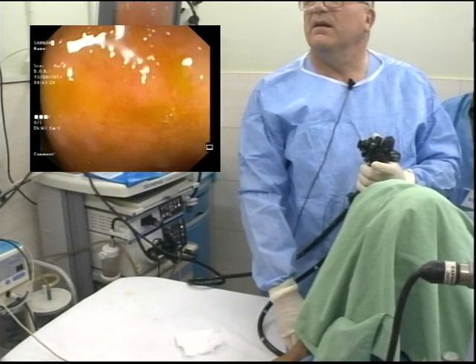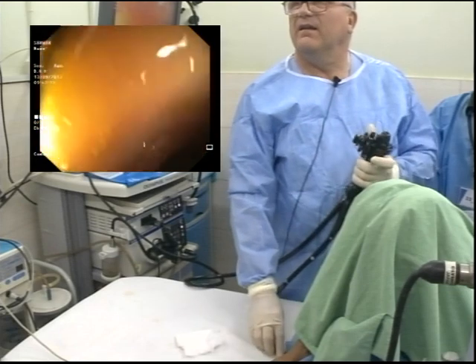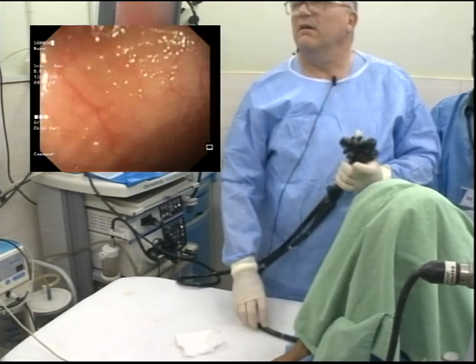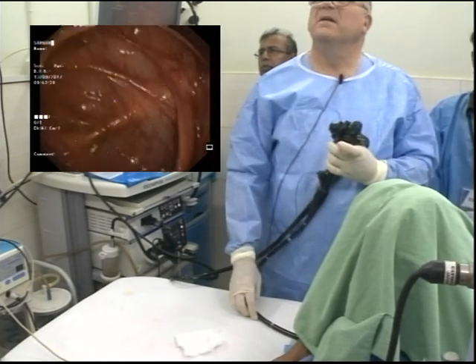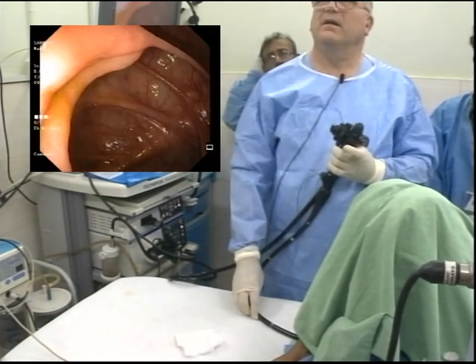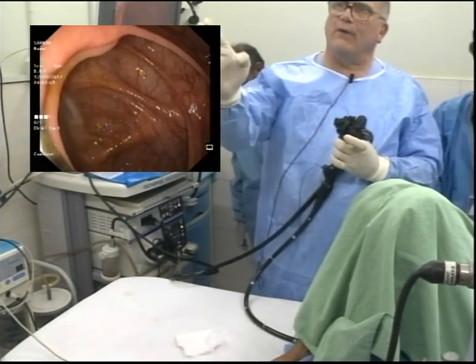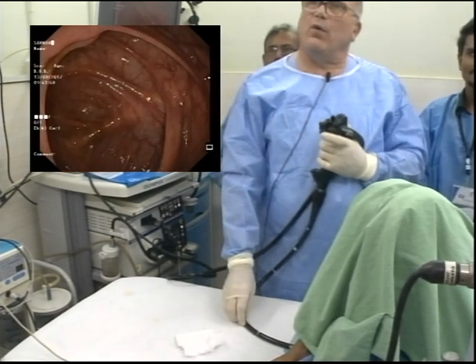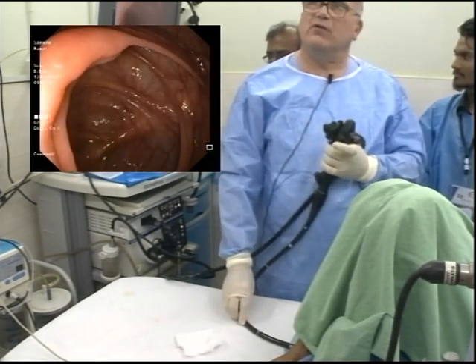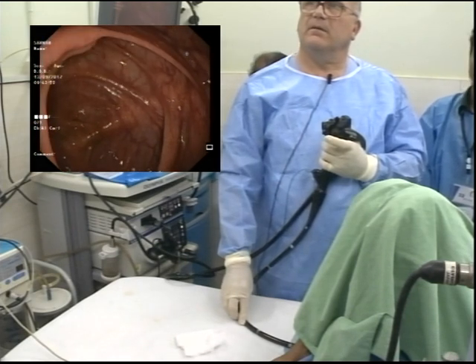Yeah, you can see some. It's good enough. We believe you're in the terminal ileum. The ileocecal valve is absolutely normal in this patient. It's a nice ileocecal valve. And I always like that picture. Get them all, three components. So back to the room, what are all three components of the cecum that you can see in this one picture?